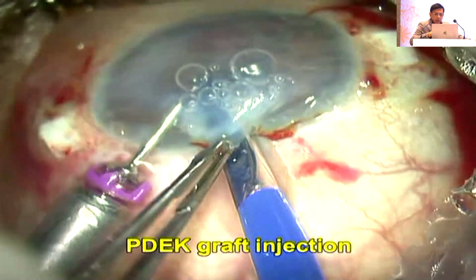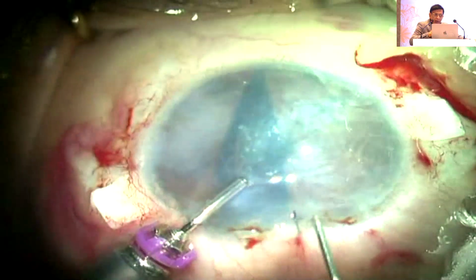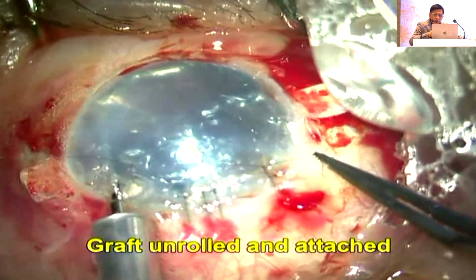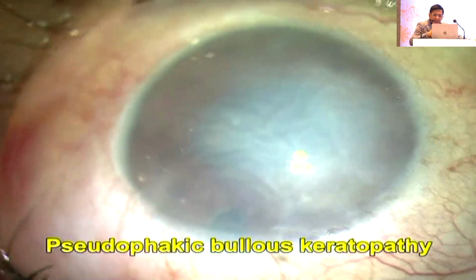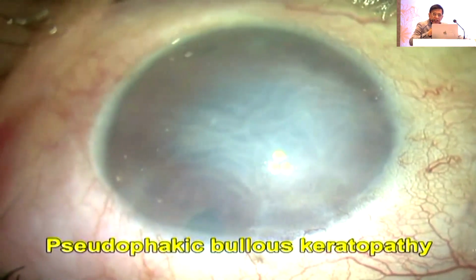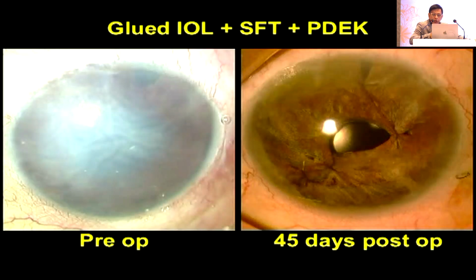The question comes now, how did this patient do? So why am I doing PDEK? Why am I not doing DSAEK or DMEK? One, I use young donors. Two, my manipulation is easy. Third is, I do not get detachments, rebubblings. My rebubbling rate is only about 3%, whereas if you see DMEK in books or literature, it's about 25 to 30% by people.